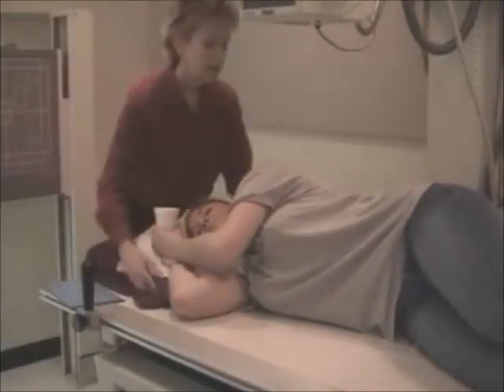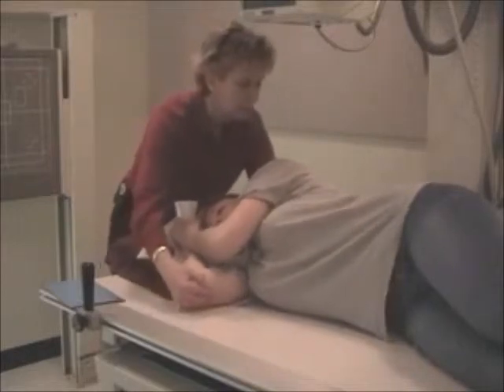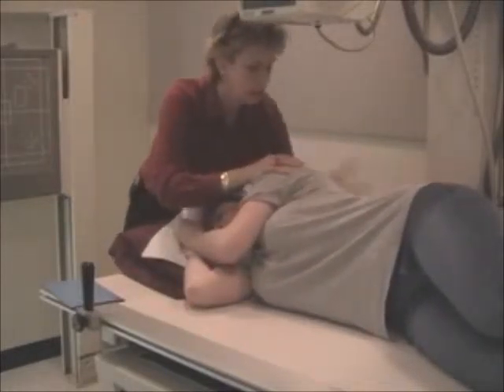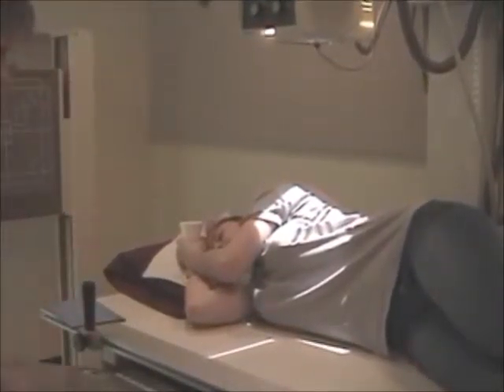Make sure they're straight on the table and in a lateral position, checking their hips and their shoulders. And the film's edge will remain at the level of the mouth. You would change cassettes, and with a right lateral, I'd use a right marker, again moved in a ways. And the film's edge will be level with the patient's mouth.